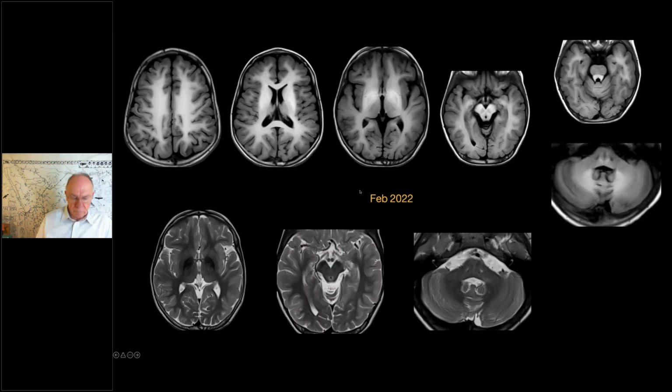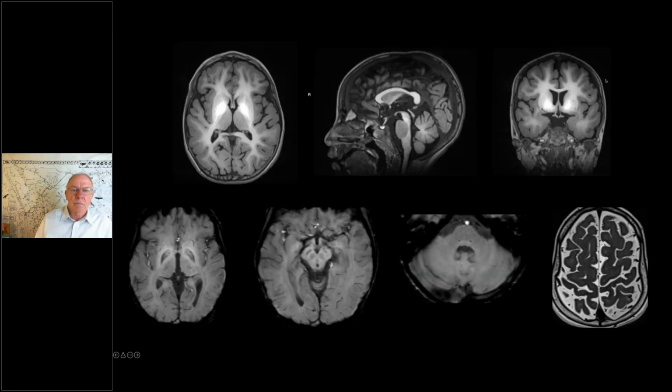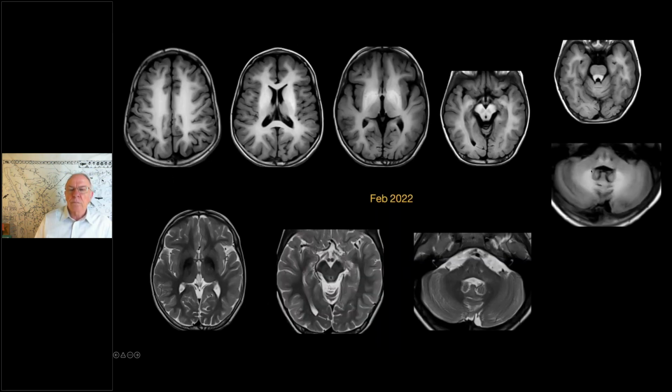Yeah, so this was done a couple of days back. This is a T1 non-contrast axial sequence. Again, the white matter is diffusely hyperintense. The basal ganglia are also hyperintense. The thalamus is relatively isointense in comparison to the rest of the white matter and the basal ganglia. You can also appreciate the changes in the midbrain, with some sparing of the red nuclei on both sides. The dorsal pons also demonstrates these hyperintense signal changes. And the cerebellar white matter, that is the dentate nucleus, demonstrates T1 hyperintensities. Corresponding T2 low signal changes were only seen in the bilateral globi pallidi and the cerebral peduncles.